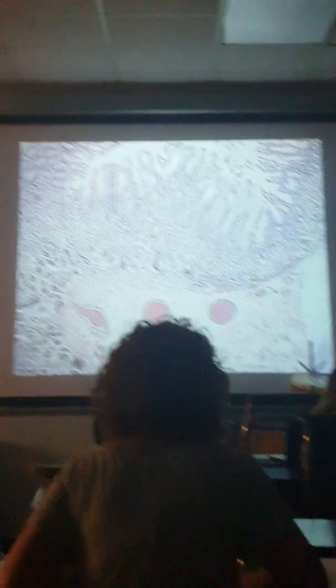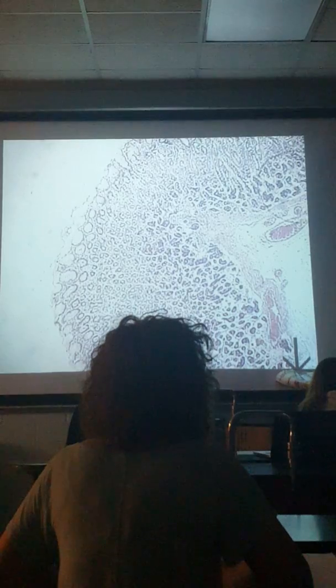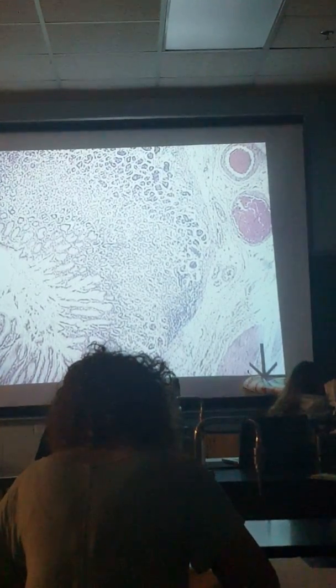This is more like the inside of the body where everything's really happening. You have more developed structures. But you see those lumps. I can't zoom out anymore. This is 4x already. Stomach.